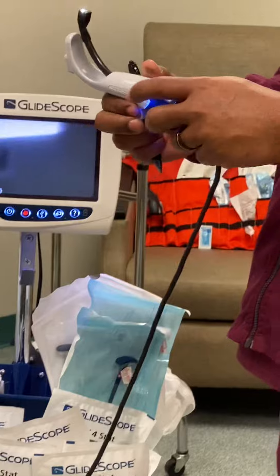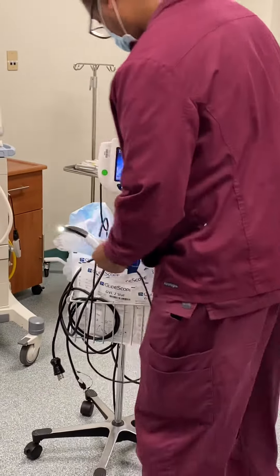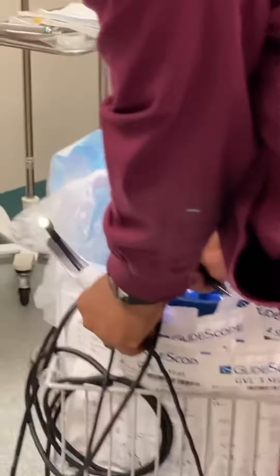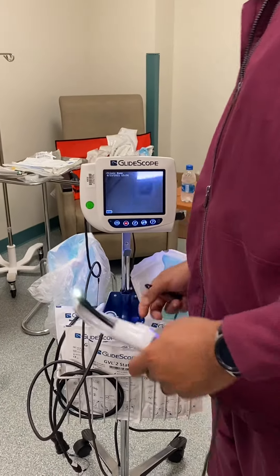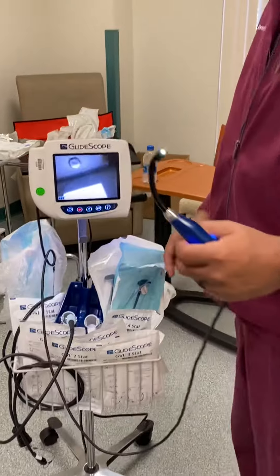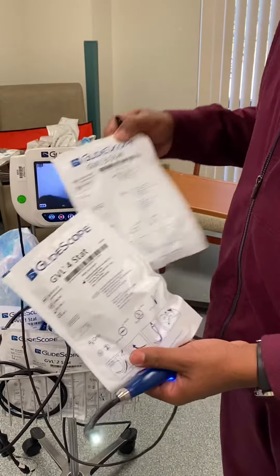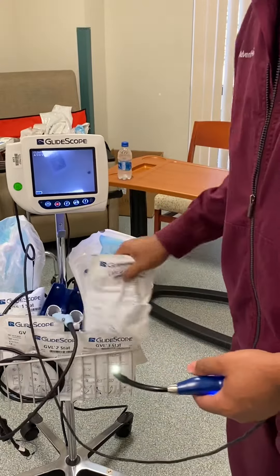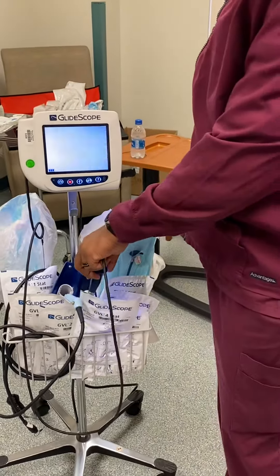This one is for the adult. There should always be a size four and a size three in the basket for adults. These are all doctor specific — they'll tell you whichever blades they're comfortable with.